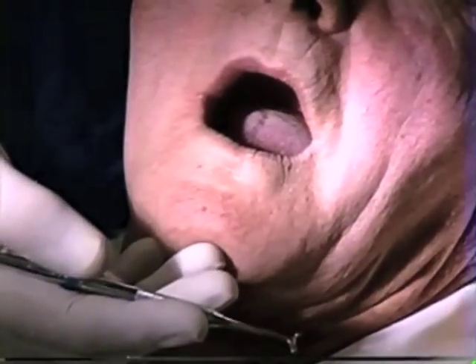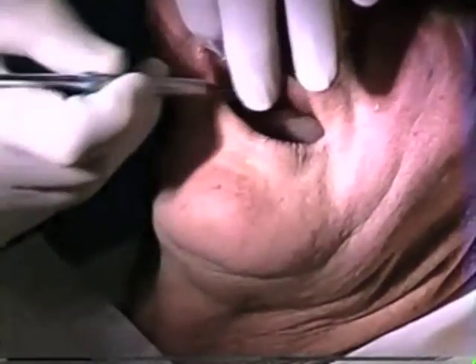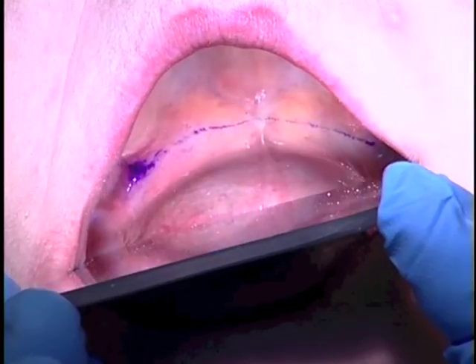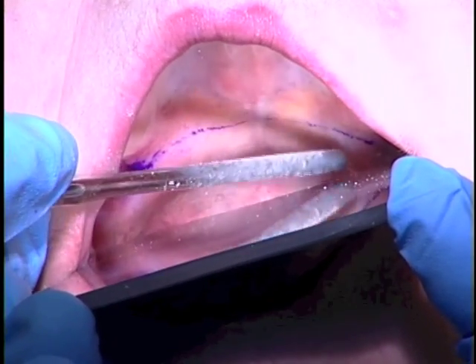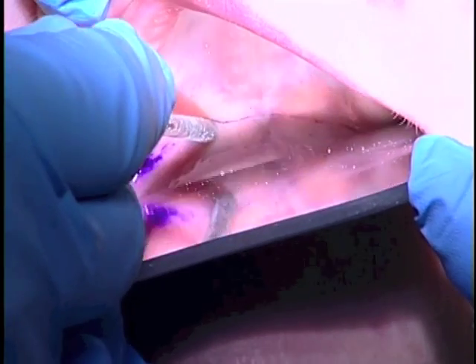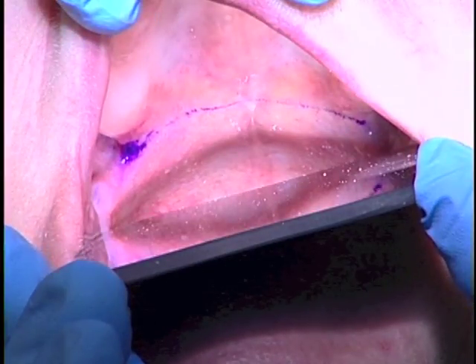The next thing we want to do is take a rounded end instrument and feel for how much displaceable tissue we have in that bed of glandular tissue just anterior to the line that we anticipate will be the posterior limit of the denture. We can palpate that and make a judgment as to the width and depth of that layer of palpable tissue. The object is to use the rounded end of the instrument, palpate just anterior to the line, and by evaluating that I can know the size and shape of the posterior palatal seal.